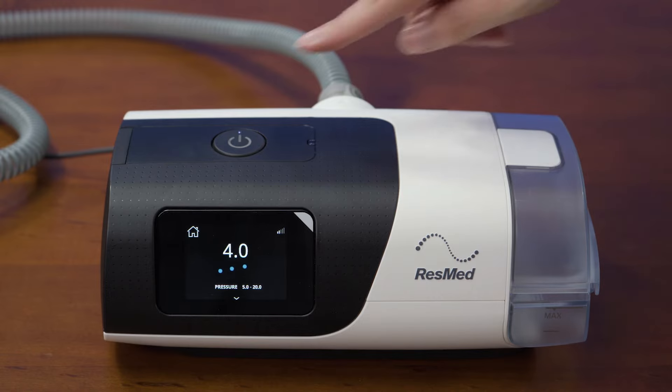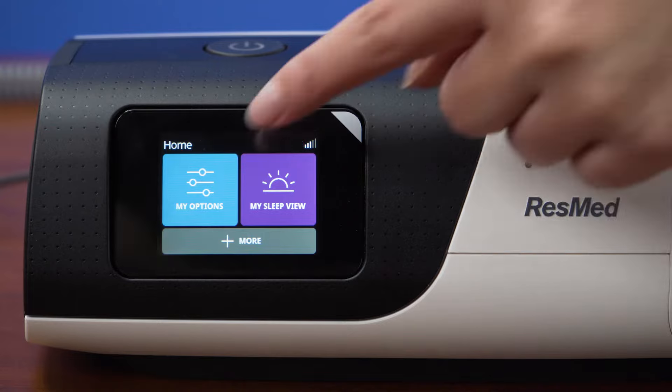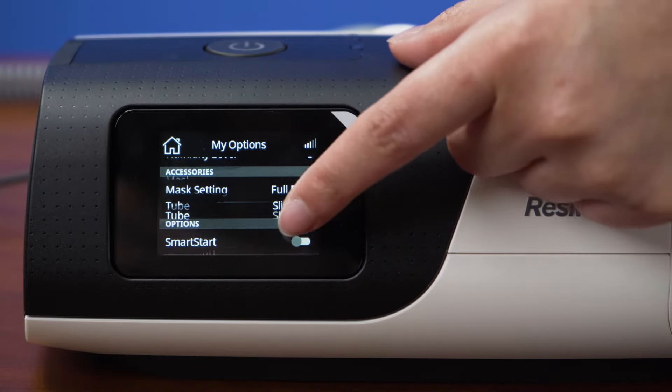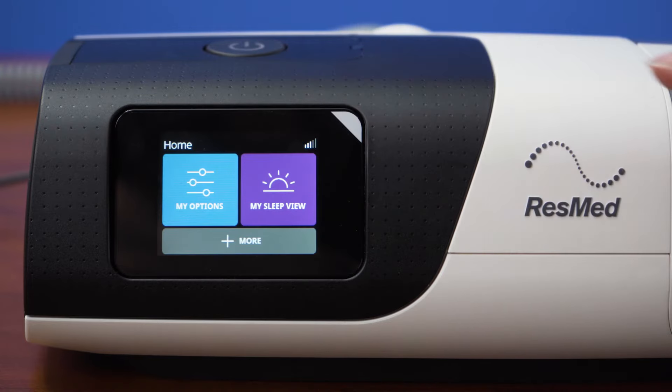The screen on the front of the machine is a touch screen. Here you should see a my options tab, my sleep view, and a more tab. If you tap the my options tab, it will bring you into another menu. In this menu, there are different options to change settings like ramp time, humidity level, and mask setting.